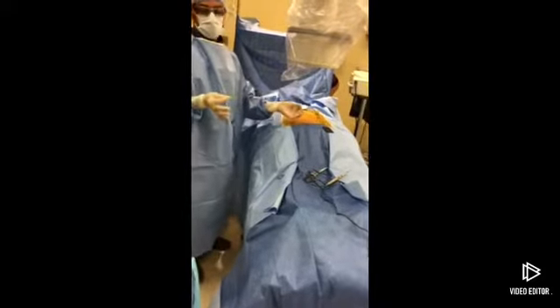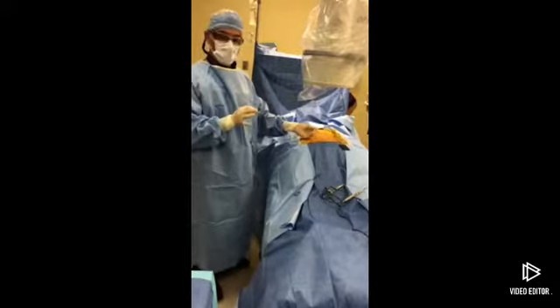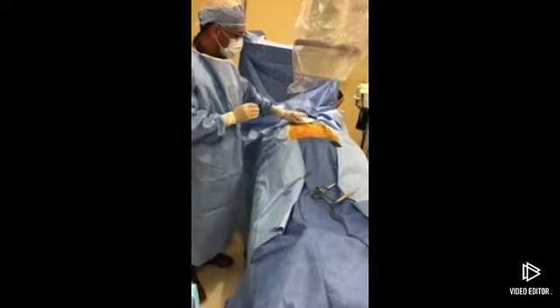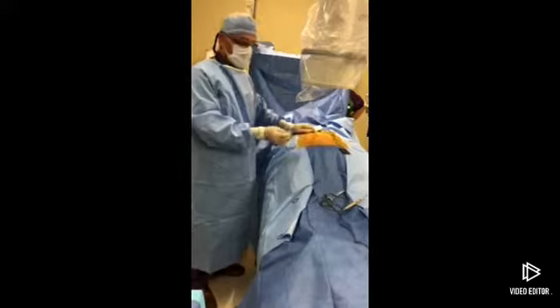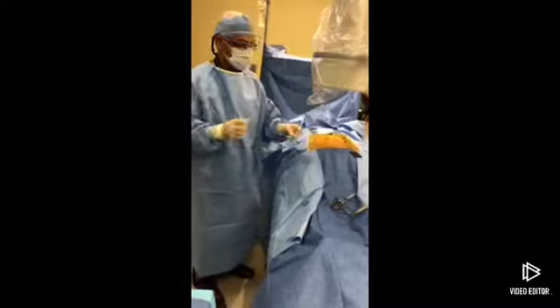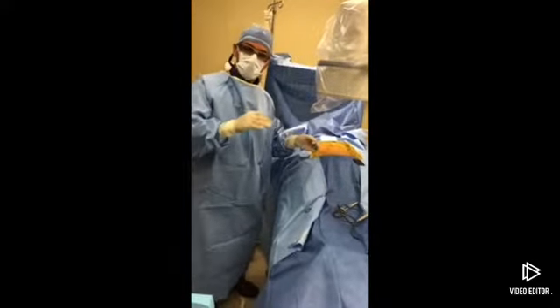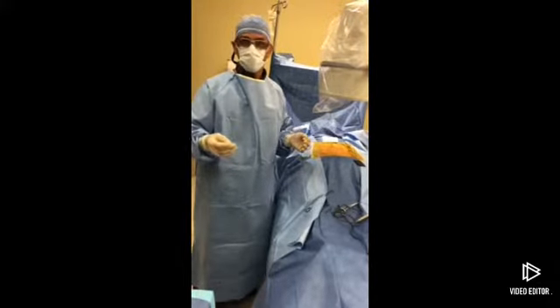What we're going to do is simply with a needle, this procedure is essentially done just through a needle. It's very simple. The patient is awake, she's slightly sedated, but it's otherwise an outpatient office type of procedure. Pass this into her spine, have it rest on the back of her spinal cord, and then take the other end of this cable and attach it to a battery, which we'll show you later. Then the patient can deliver electrical sensations through these contacts to stimulate her spinal cord, which will block the unpleasant pain sensation and replace it with a more pleasurable pins and needles type of sensation.